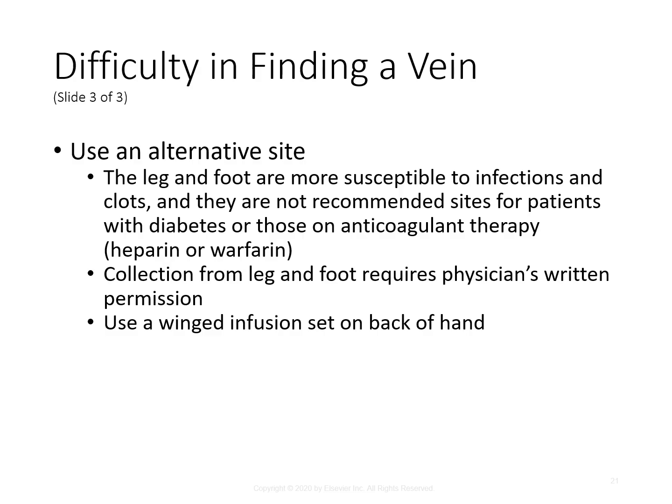The leg and foot are more susceptible to infections and clots, and they are generally not recommended sites for patients with diabetes or those on anticoagulant therapy such as heparin or warfarin. Collection from the leg and foot is also going to require a physician's written permission. So this is not something where you look at their arm, don't see anything, and jump to their leg. It's going to be a whole process where you have to actually get written consent from the physician.